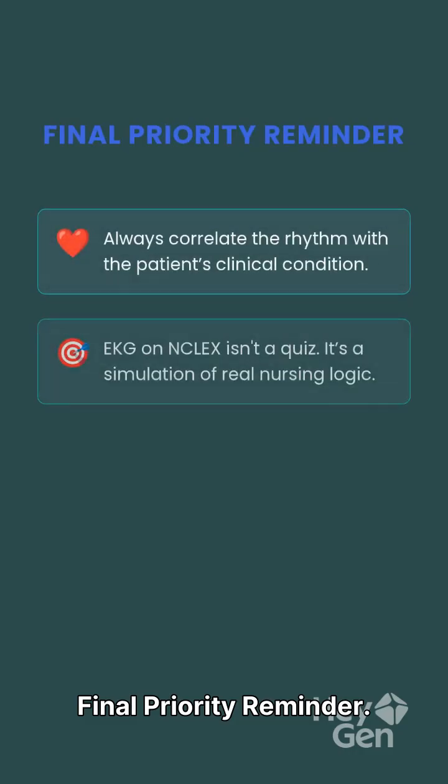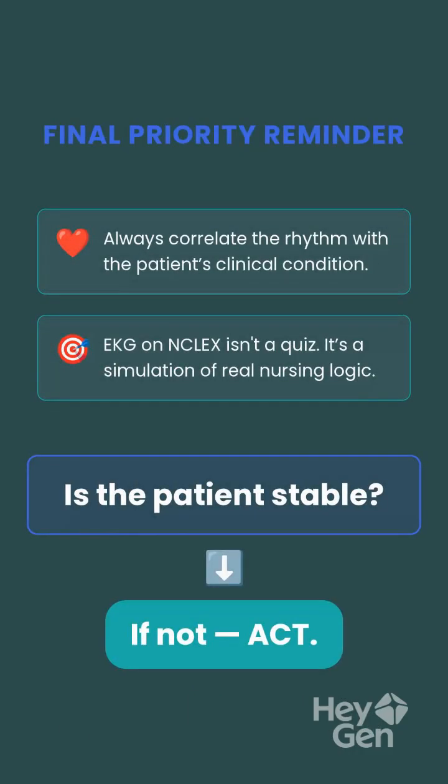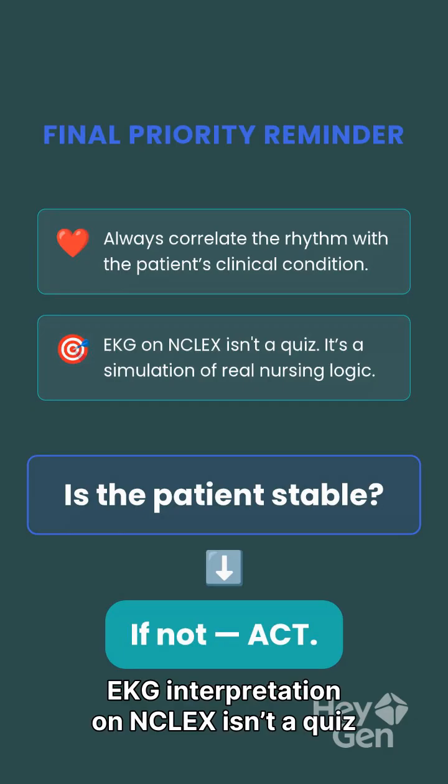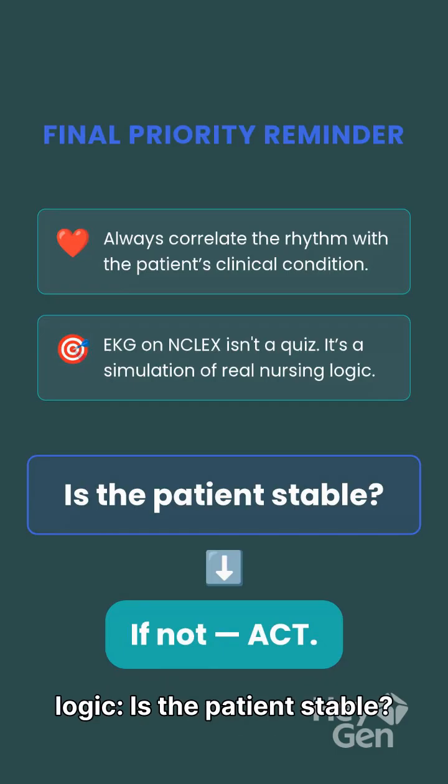Final priority reminder. Always correlate the rhythm with the patient's clinical condition. EKG interpretation on NCLEX isn't a quiz, it's a simulation of real nursing logic. Is the patient stable? If not, act.